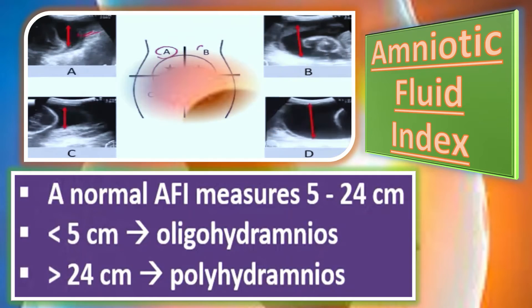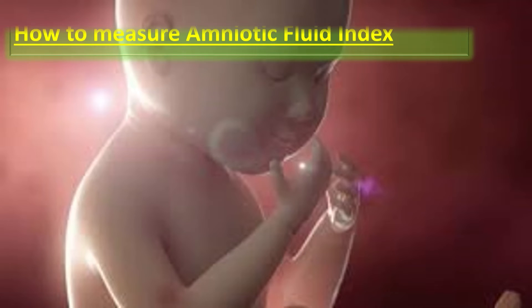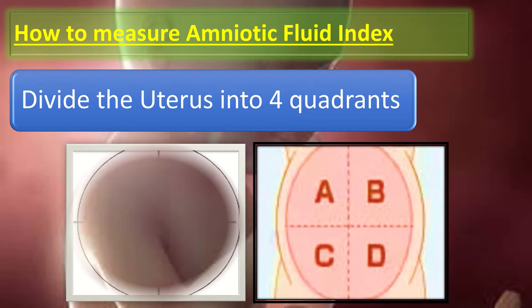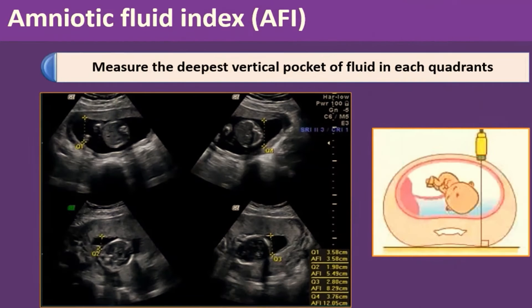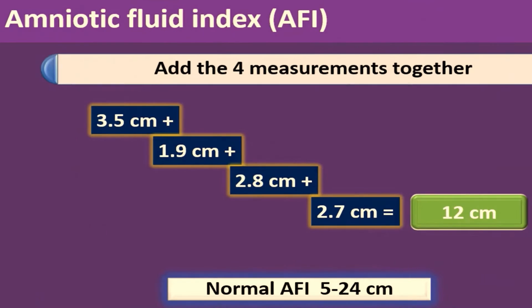How to measure the amniotic fluid index: step one, divide the uterus into four quadrants A, B, C, D; step two, measure the deepest vertical pocket of fluid in each quadrant; step three, add the four measurements together to get the amniotic fluid index. When the AFI lies in the range of 5 to 24 centimeters, that is normal. In this example, the values from the four quadrants are added to get the AFI, which is 12 centimeters — within the normal range.